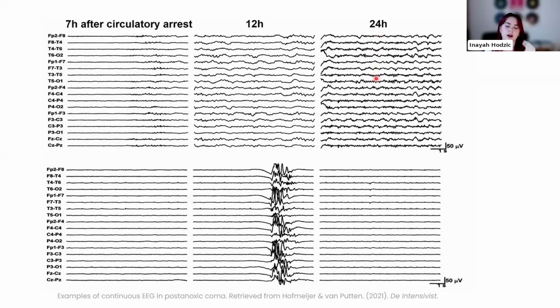And the 12-hour and 24-hour marks are very important key moments when it comes to EEG recordings, and many guidelines actually encourage the outcome prediction to be at either 24 hours or around this hour, with some indicators already appearing at 12 hours. But those are key moments within the entire continuous EEG in clinical practice.